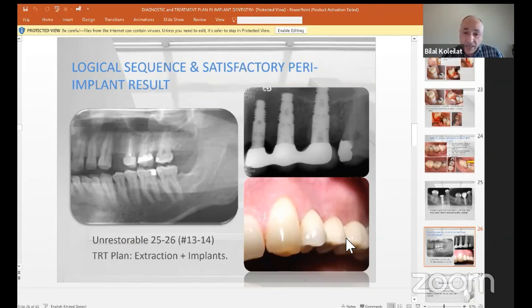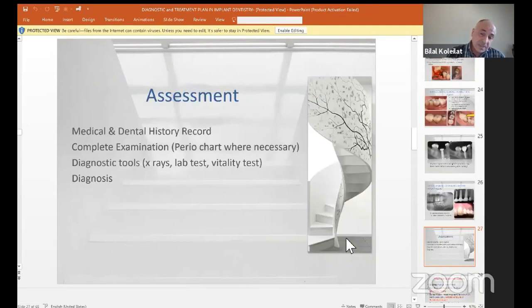But now, if you ask our prosthodontist why he connected these 3 implants, they are parallel, they are in good direction. Always they say it's easier for them, but it's more difficult for the patient for the proximal hygiene. We finished a part of this misplanning and the logical sequence. Now we will go for the proper assessment when we want to do implant surgical placement.